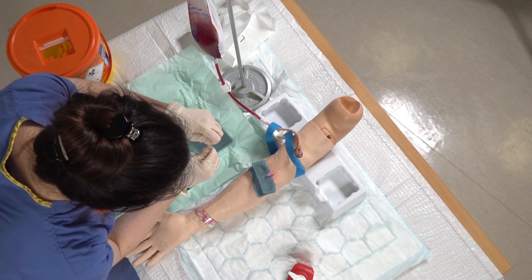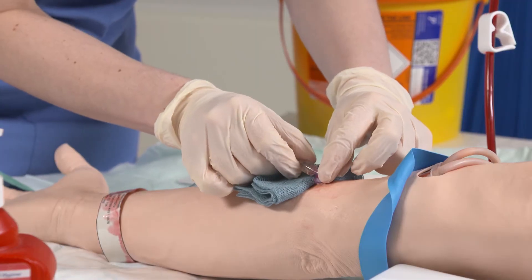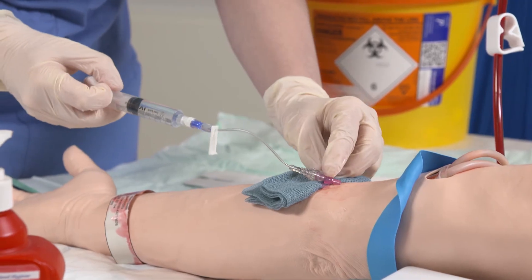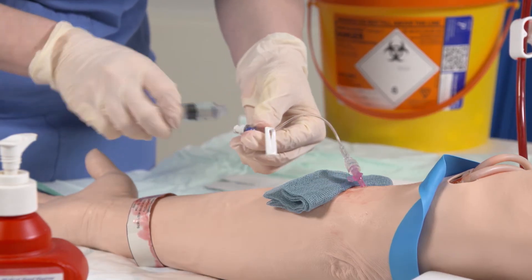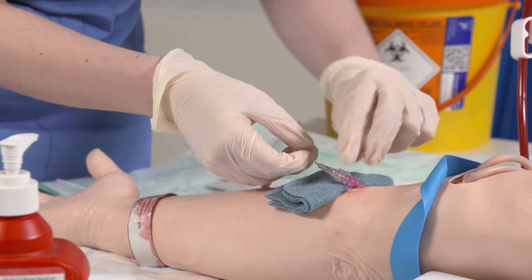Then with my pre-prepared flush, just remove the cap, pop that onto the end of the cannula and then flush that fluid through. It should feel nice and easy to go through. And then just put the clamp across.